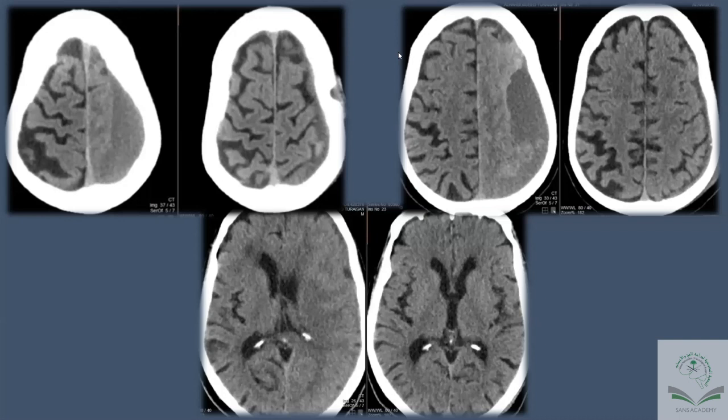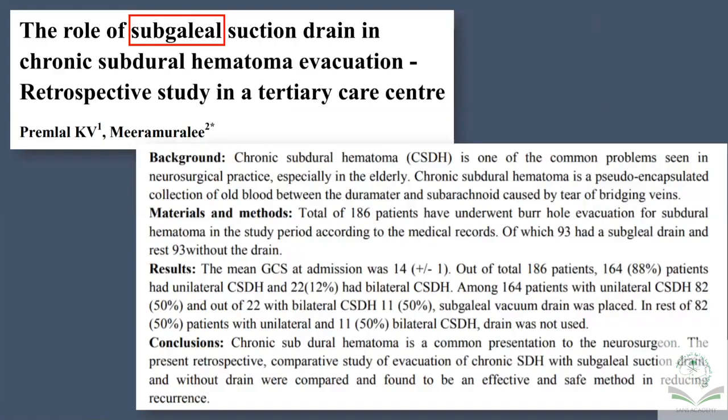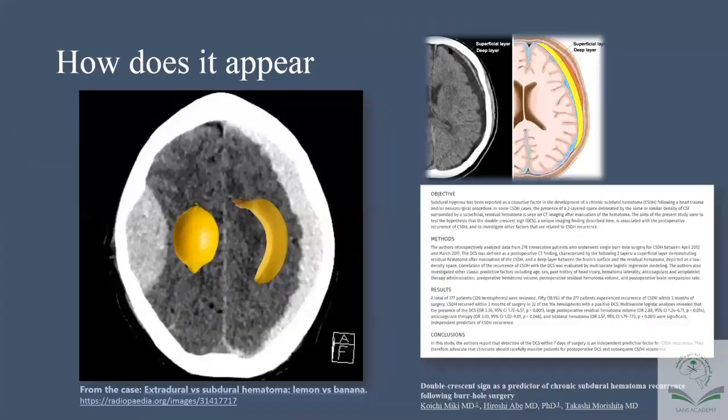We have a question here about the newly published double crescent sign. Have you seen it in our population, and is it really significant? Yeah, and this is what I mentioned in the beginning, that it indicates on the CT and MRI. I will bring the image again. Yeah, so this is the double crescent sign that proposes that it is a subdural hygroma or a subdural hematoma. And that is the layer of the dura being hyperdense. So you have the epidural, the dura, and then the subdural space. I did not look for it actually in the images, but maybe if we look, we can see more.